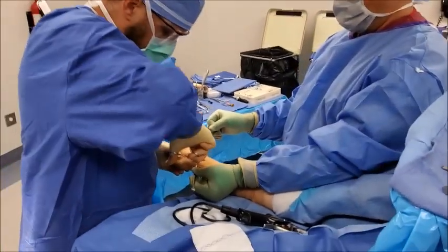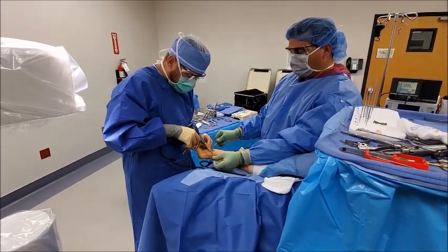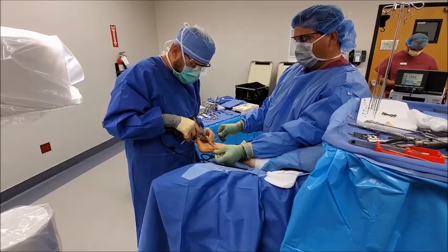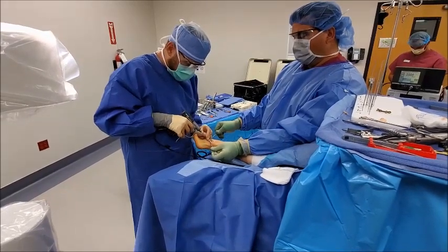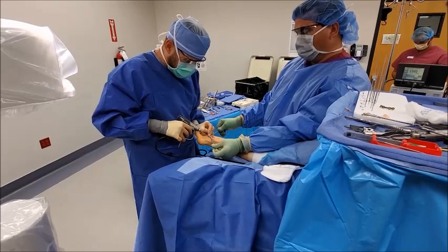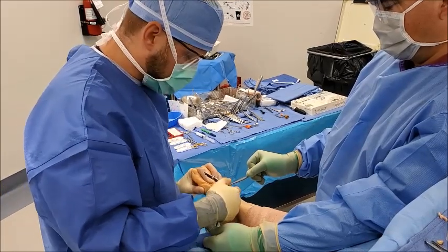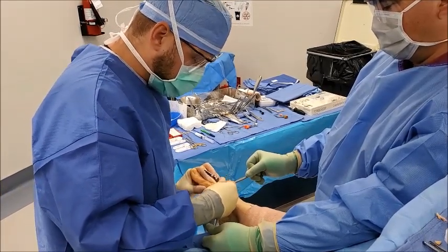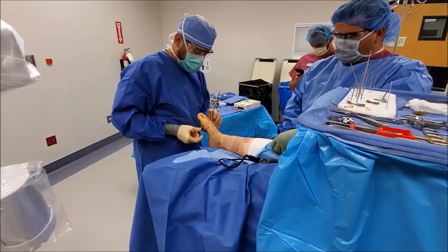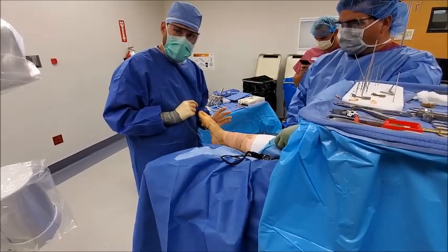Once we have raw bone, we can fuse those two surfaces together just like a fracture heals after an injury. The next step is fenestrating, or drilling multiple holes into the joint, which allows bone cells to cross the gap and fuse the two bones together. We then oppose the two surfaces so those bones can fuse and maintain the correction. The compression clamp brings the two edges together to allow healing, and we place two small pins to hold our reduction while we remove the compression clamp and perform the actual plating of the surgical site.